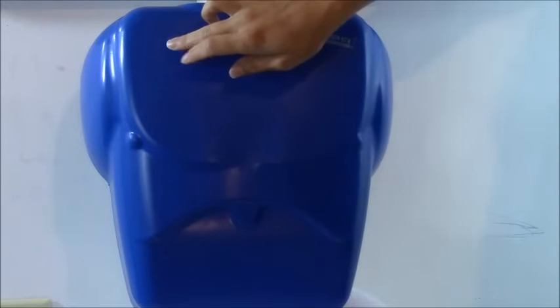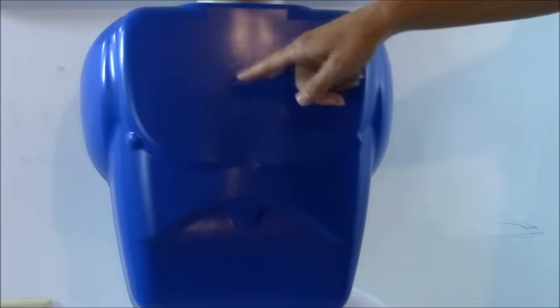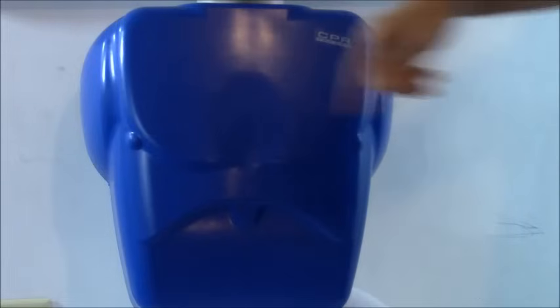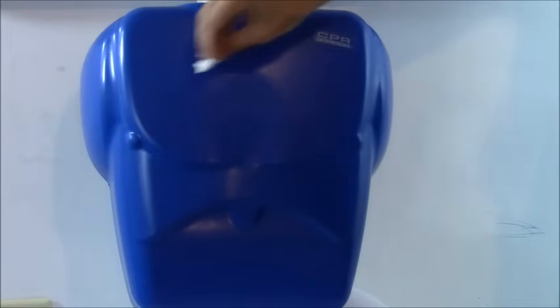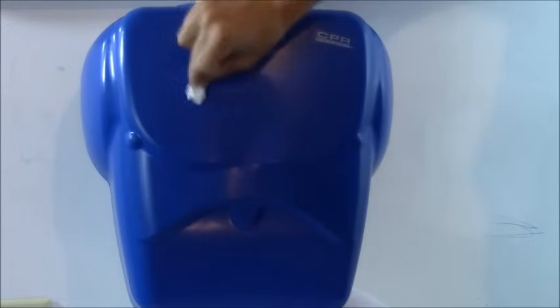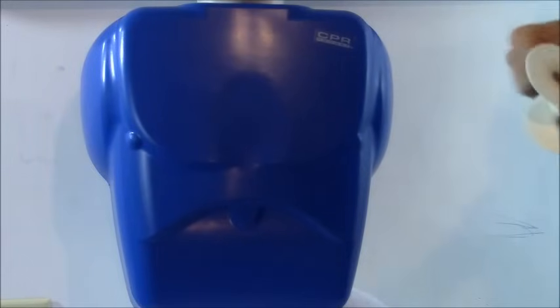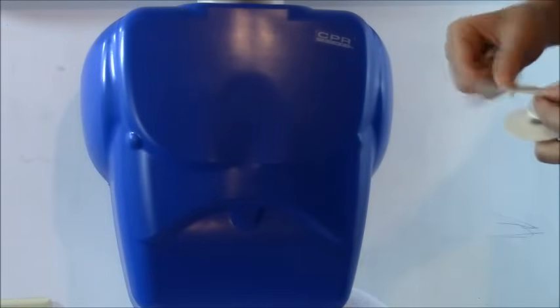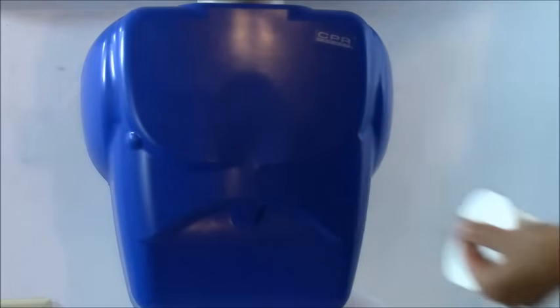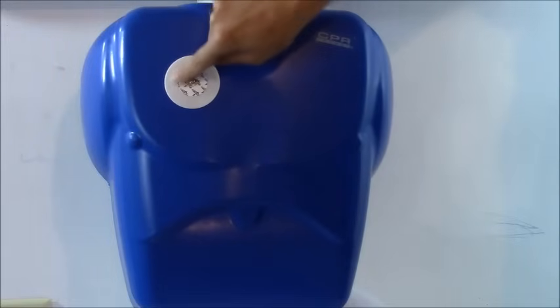So your right arm lead will go in the second intercostal space of the ribs, so about right in this area. And how you want to prep the skin is you want to take your alcohol prep and clean the skin really good to get those oils off. And then lightly take your exfoliation paper and just scratch on the area lightly just to rough it up and then peel the backing off of your electrode and place it on the skin. And make sure you put it down really well.